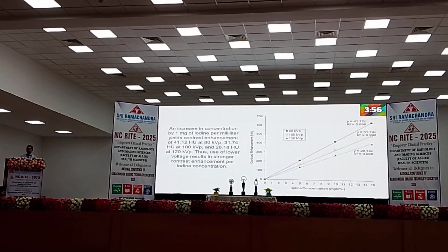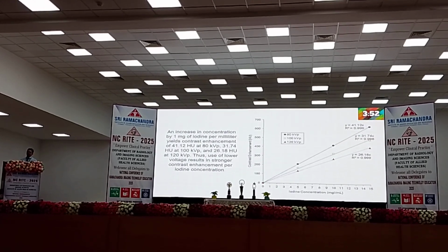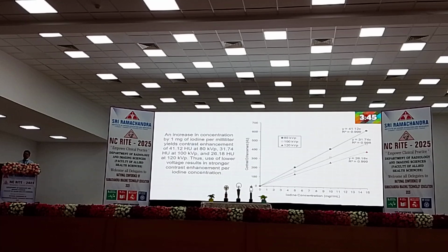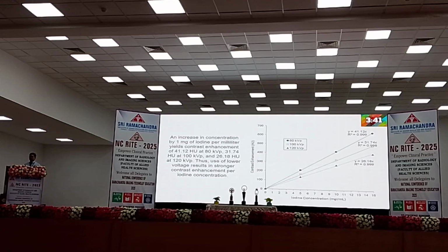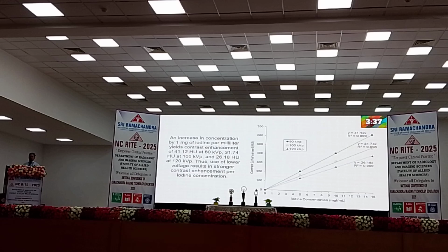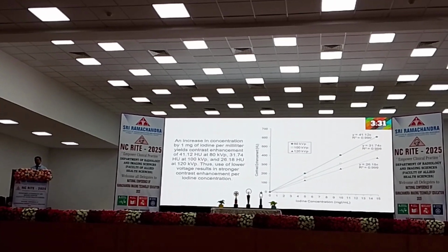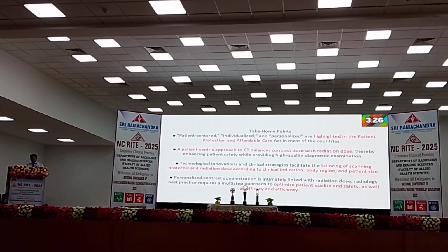It means whenever you are conducting a scan, kVp is also one of the important factors. Most of the time, even in my study days during my BSc, I was thinking that due to contrast, if I inject more contrast, there is more enhancement. Right? No. Later I realized, because I did my thesis during my PG on this topic, that due to variations of the kVp, the Hounsfield unit will also vary. So whenever we are setting the kVp, we have to keep in mind that the Hounsfield unit will also vary according to the kVp. Okay. So these are the take-home points.